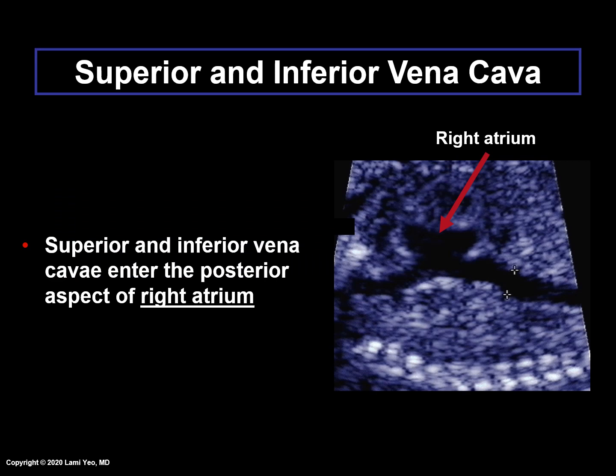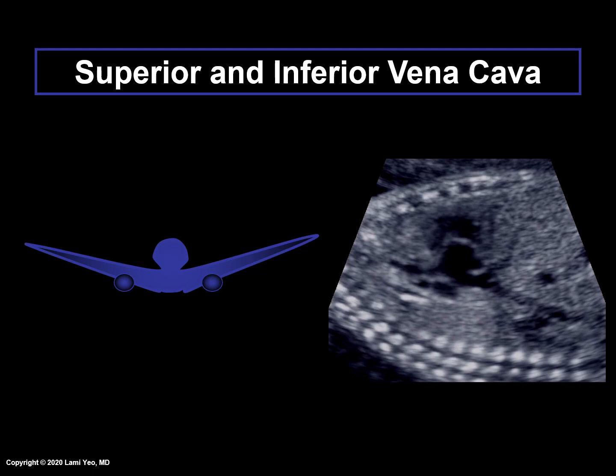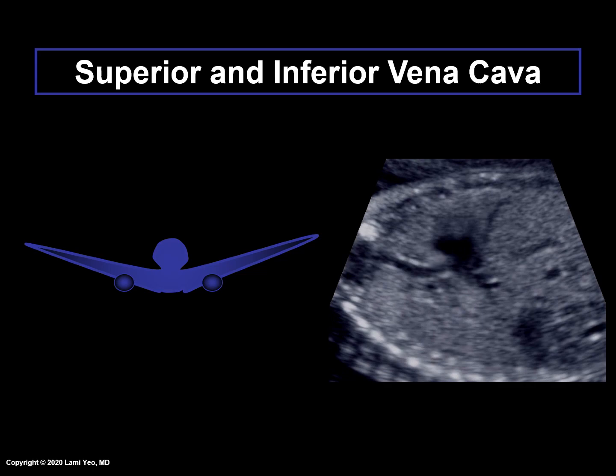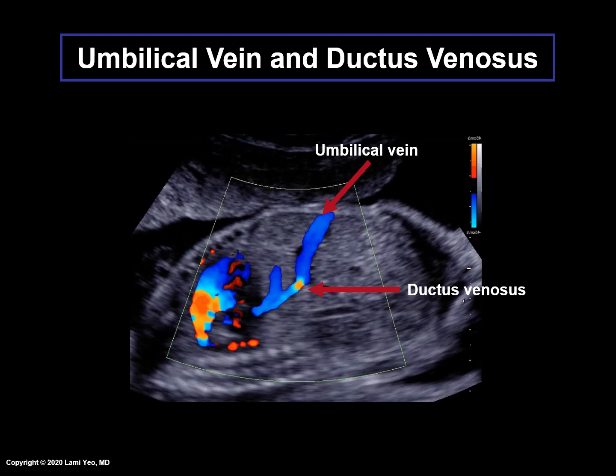Superior and inferior vena cava. In the right sagittal plane, the superior and inferior vena cava should be visualized entering the posterior aspect of the right atrium. Here is a video clip showing both vena cava entering the right atrium. This has the appearance of looking at an airplane which has landed at the airport, in which the wings are the superior and inferior vena cava. The inferior vena cava should not be confused with the umbilical vein and ductus venosus shown using color Doppler imaging in this video clip.